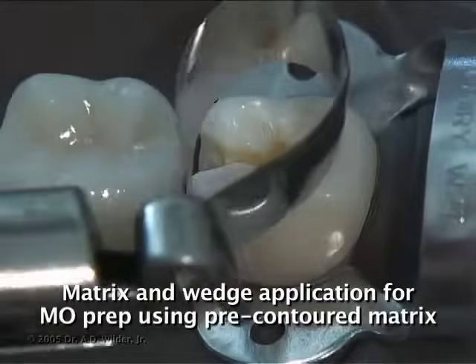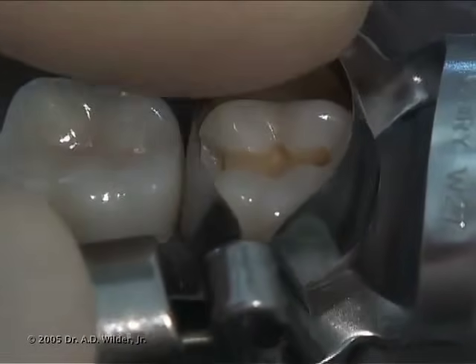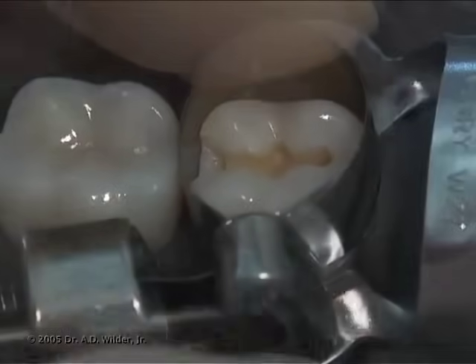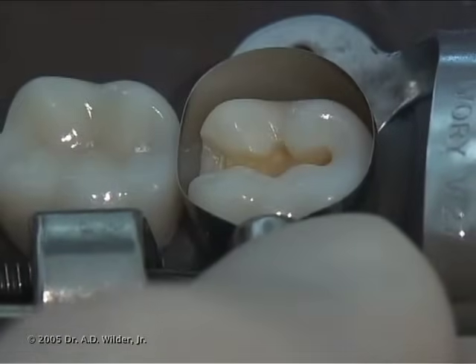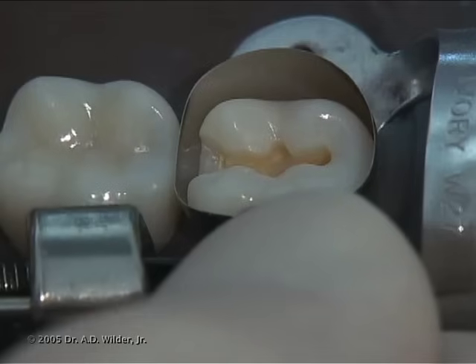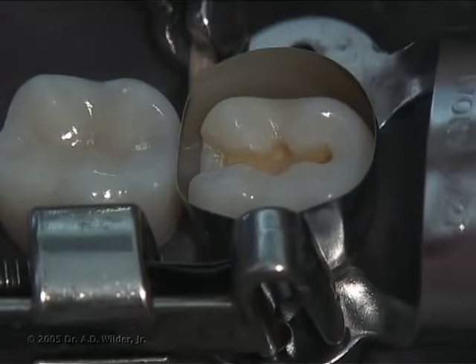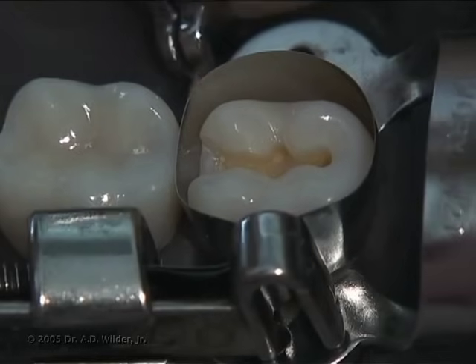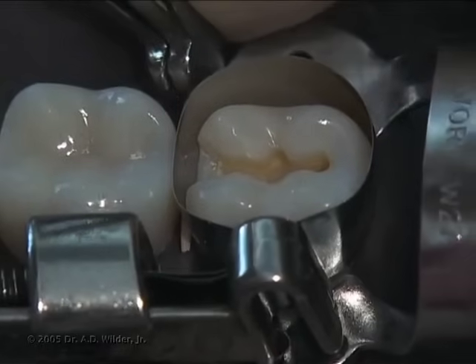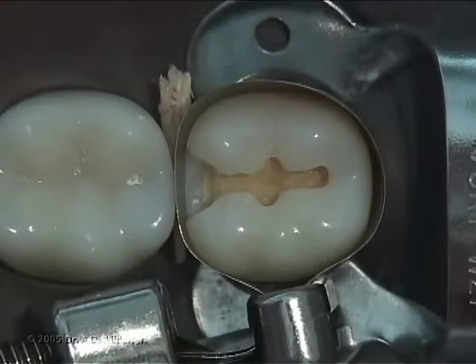Fit the matrix band carefully over the tooth, making sure that the bottom of the band goes below the gingival floor of your proximal box so that there is no gap. Once the band is properly positioned and tightened, place a wedge under the gingival margin between the tooth and the matrix band to secure the band against the tooth. You can also burnish the band against the adjacent tooth at this stage.